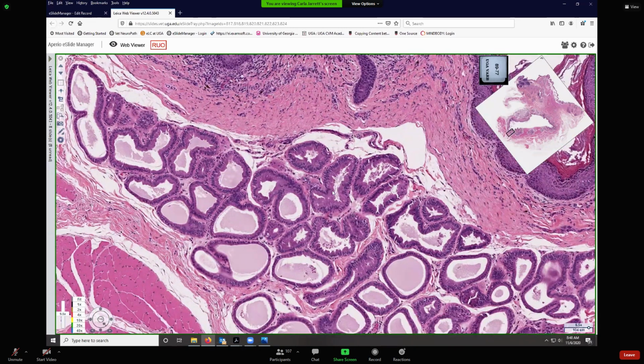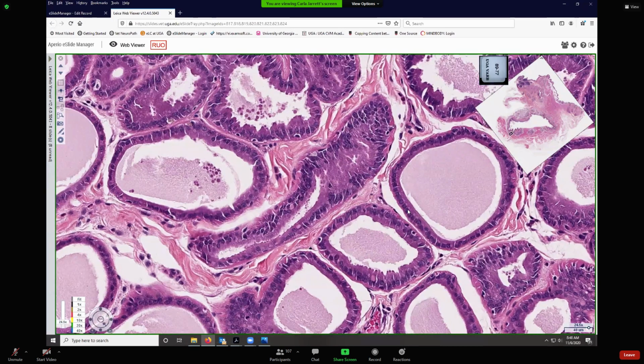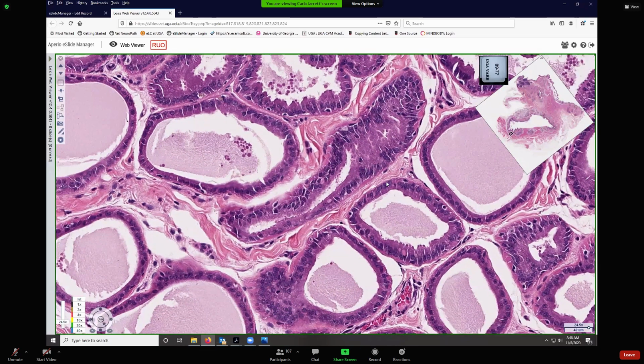Here, this shows you that these are called the glands of the anal sac. They are a type of sweat gland. They surround and empty into those anal sacs. And this shows you that they're just modified sweat glands or sudoriferous glands. And you can see that they'll have like a cuboidal to a columnar epithelium.